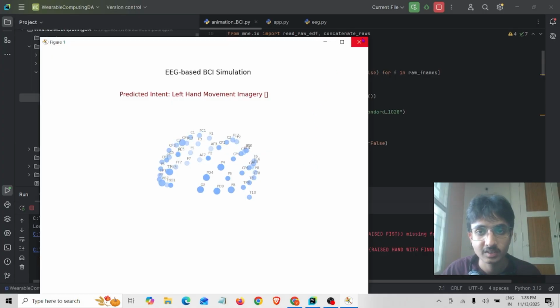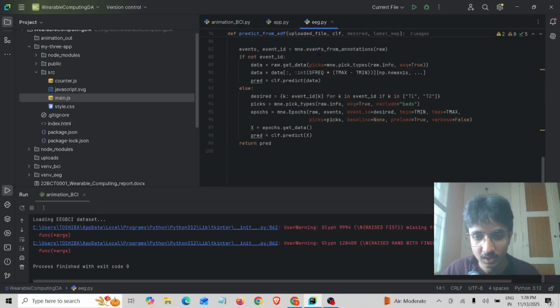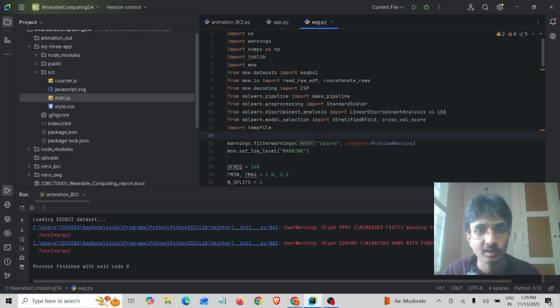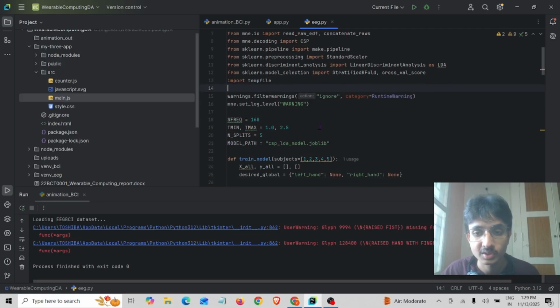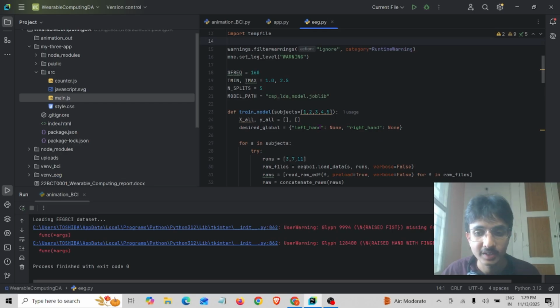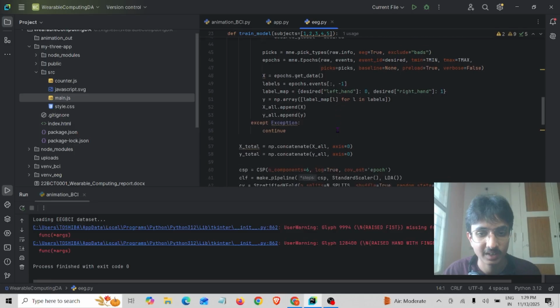Now let's look into our trained machine learning model to classify these signals. Right here is the script of the machine learning code that we have used to create our model. We first pre-process the raw data and filter it between 7 and 35 Hertz to remove noise and focus on motor related rhythms. Then we extracted features using CSP and LDA.